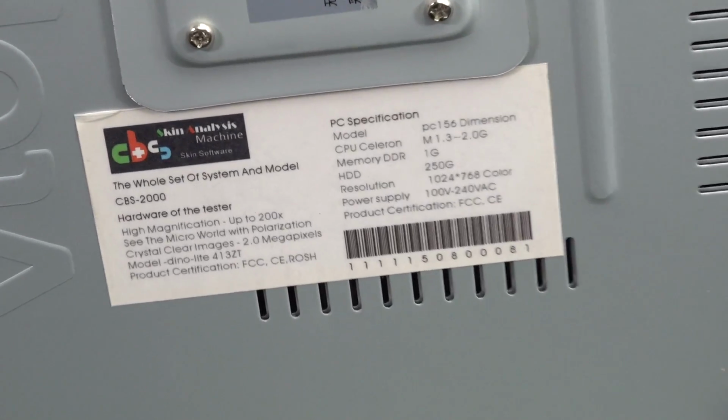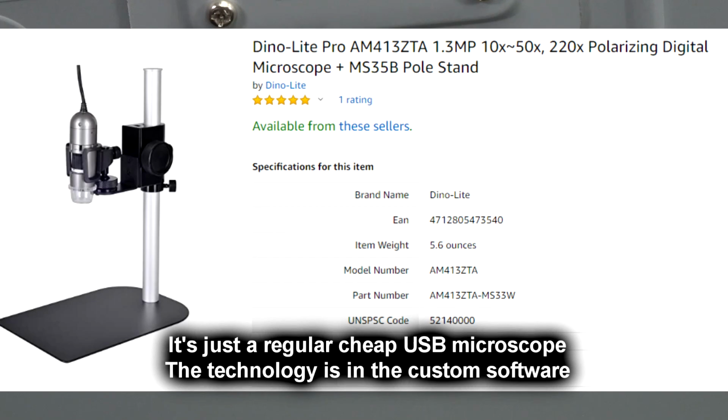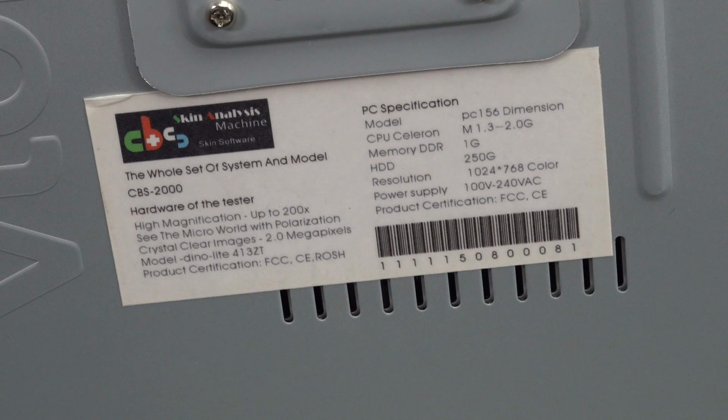For those playing along at home, let's have a look here. The whole set of system and model. It's the CBS 2000 hardware of the tester. Love it. High magnification up to 200 times. See the micro world with the polarization. Crystal clear images, 2 megapixel. It's the Dino-Lite. I guess that's the camera that comes with it. Anyway, it's a PC with a 15.6 inch display and M1.3 to 2 gig. It's a Celeron jobby. So yeah, really old, ancient stuff.